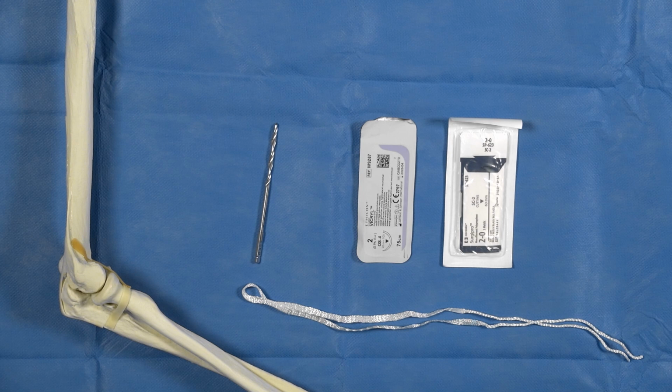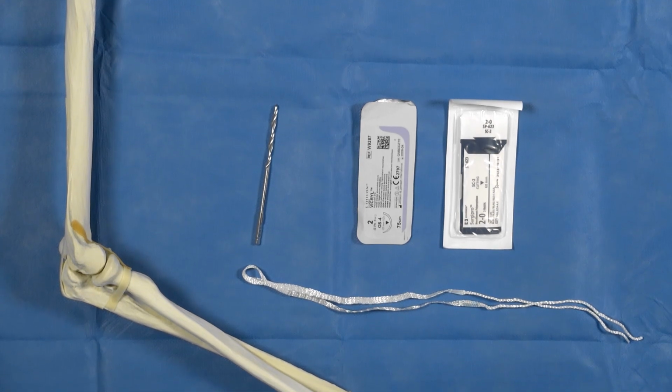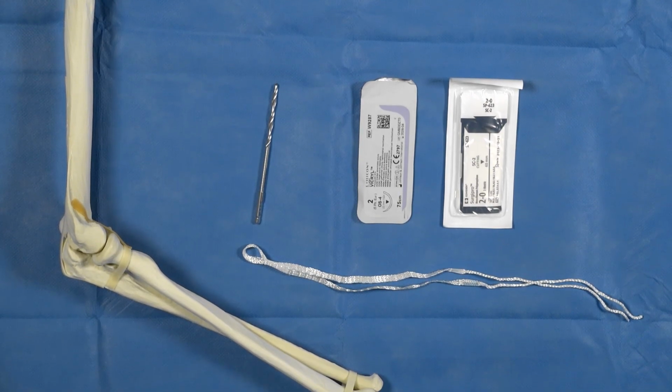graft. And the indication for the use of the synthetic graft is patients who have hypermobility, so a Beighton score of 5 or above, patients who don't have a donor graft, so they don't have a palmaris longus, although some surgeons will use a strip of triceps instead, and patients in whom you're undertaking a revision reconstruction.